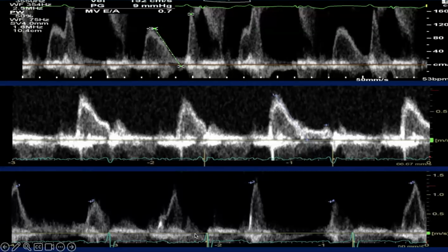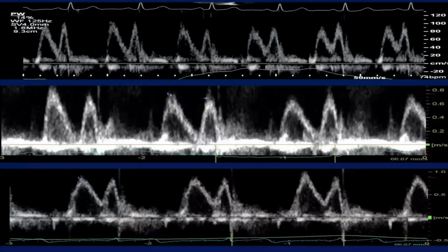But because this patient has underlying atrial activity, it will come in different shapes. So this is the A, for example. Then it gives us this wave. Then another A, and it was fused with the E. Then another A, it came exactly at the E. This is why it's so prominent. Then another A, then another. So he's having continuous A waves.